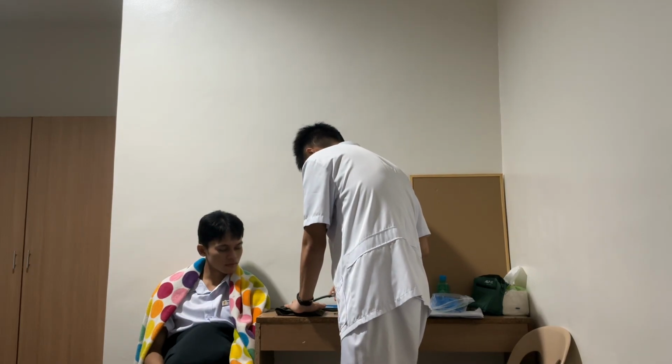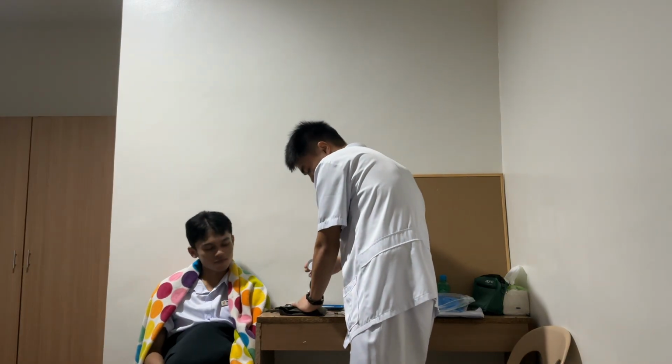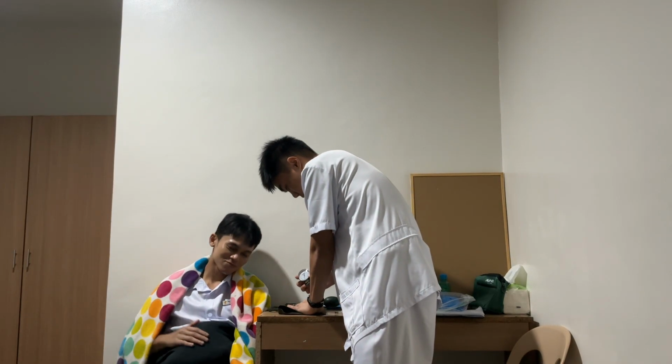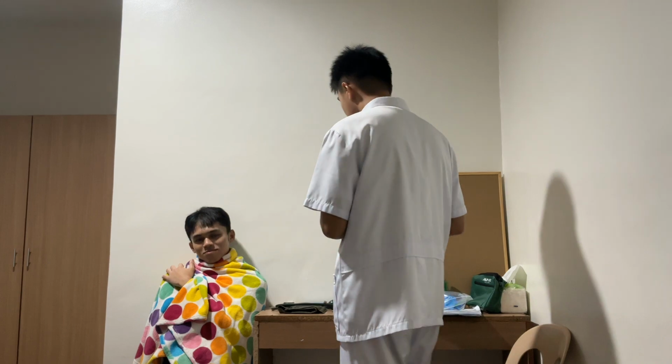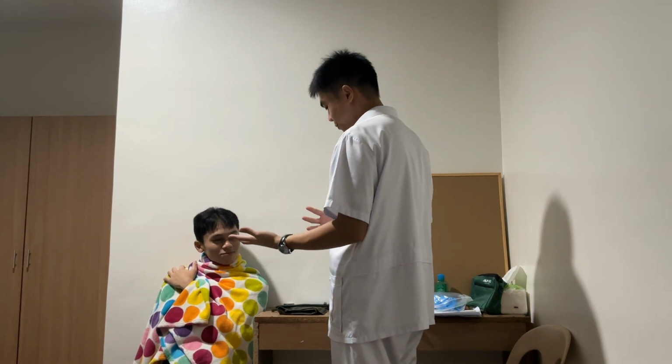So it retains, and when releasing, you can see that the indication of it rises there, but it indicates the pressure. Okay, so it is functioning well. So before proceeding, we will check with the client if she is ready for her blood pressure to be taken. So ma'am, how are you so far?